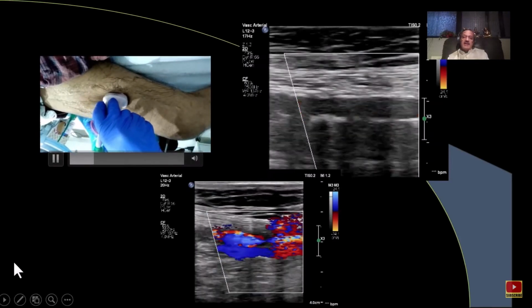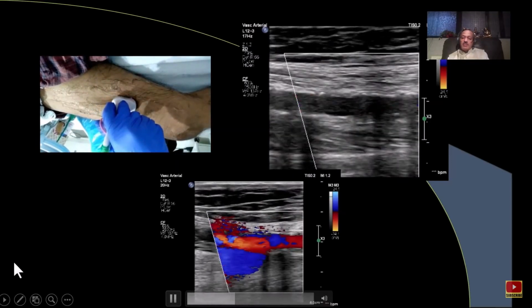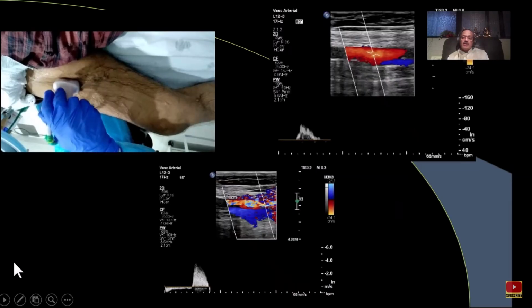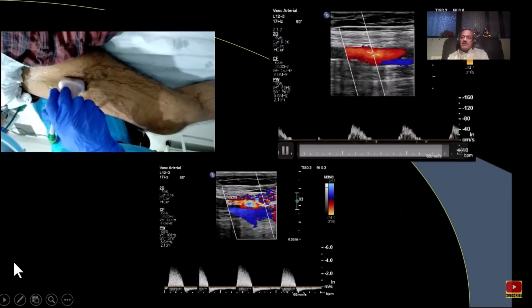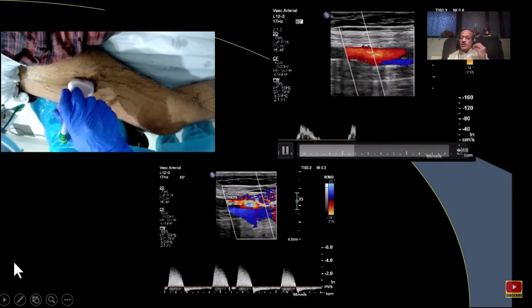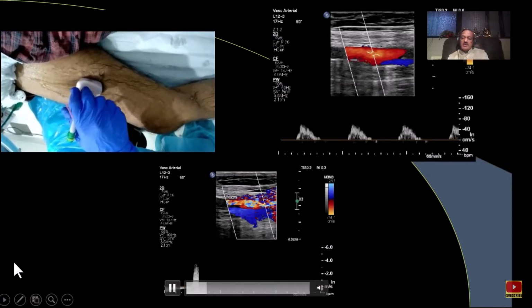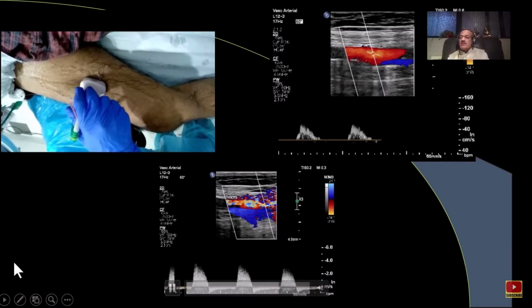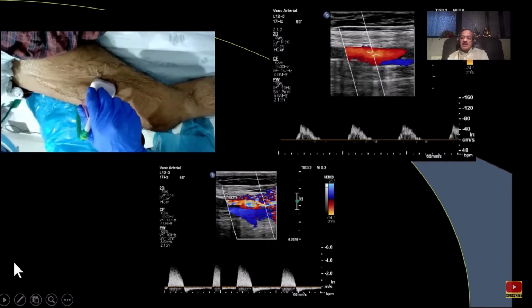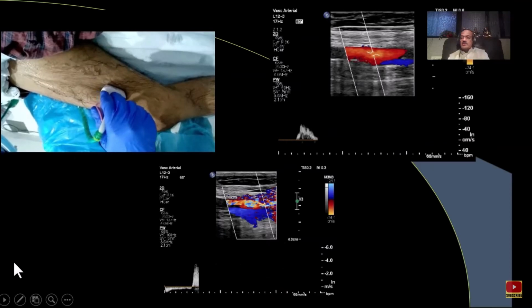This patient has a gangrene, and as we go down into the femoral artery, to the mid portion of the femoral artery, we can see this aliasing and narrowing there on color Doppler. And on pulse Doppler proximally, we can see this monophasic waveform instead of a triphasic. This again tells us that something is going to go wrong if nothing has gone wrong proximally. And rightly so, at the site of stenosis, we can see that the velocities have increased to 400 centimeters per second from 70s or 80s, telling us it's more than 50%, almost 75% stenosis.